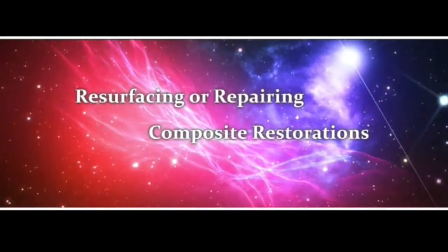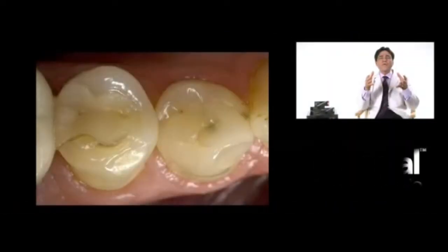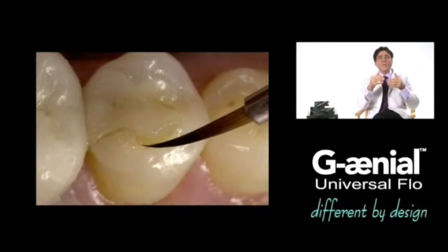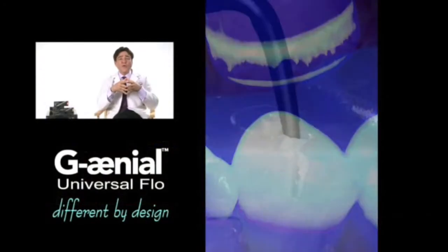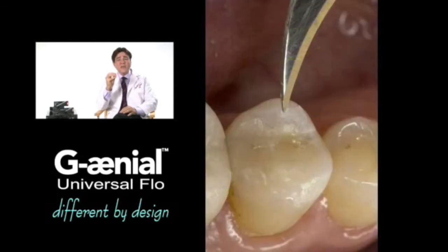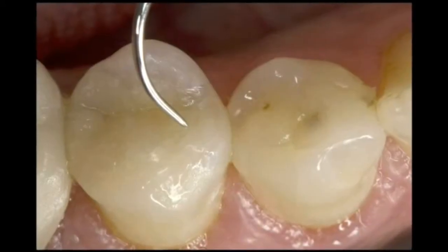To resurface or repair composite restorations. Repeated flexural forces can also cause adhesive failure of adhesive restorations at the dentin resin interface, which can result in microleakage and partial or complete debonding of the restoration. A simple indirect direct technique can be used to restore anatomical morphology from wear or fracture using these next generation flowable materials.